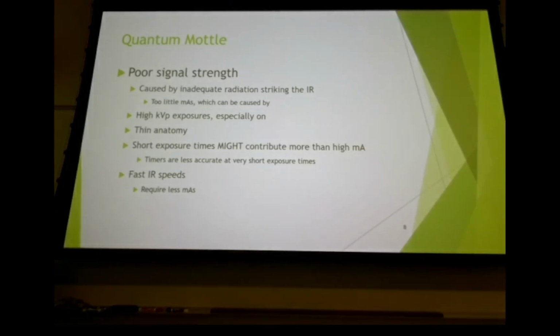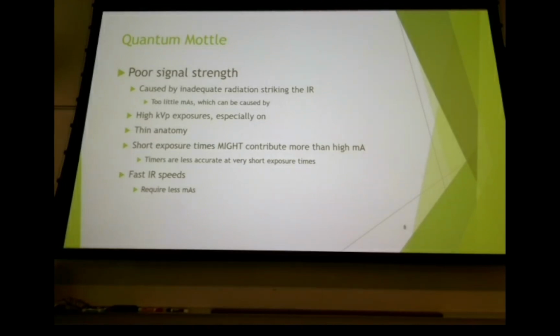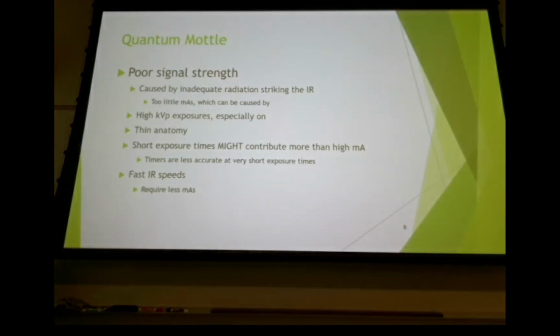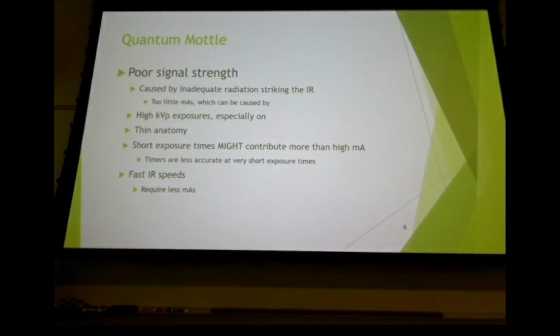And she was quick. Most of the time people go click, click, and I mean, this was so fast, it was more like a camera flash. It was really, really quick, and it was fluorescent lights, so they didn't come all the way up to full brightness as soon as she flipped them on. But I saw them come on, right? And I just kind of stood there for a second. I was like, I don't know that we got anything off of that. But I went ahead and sent it through the processor, and sure enough, she flicked those lights fast enough that it received nothing, all right?